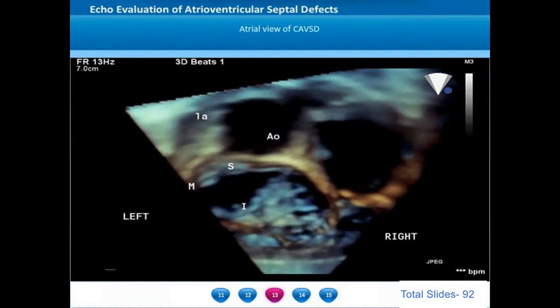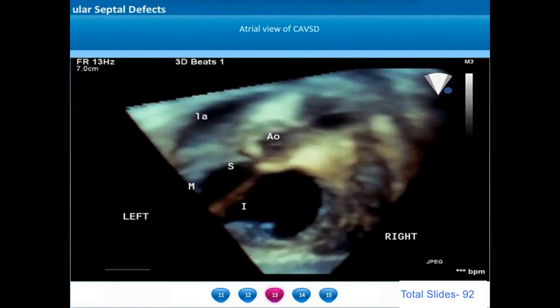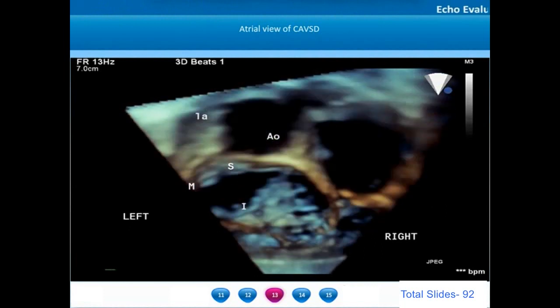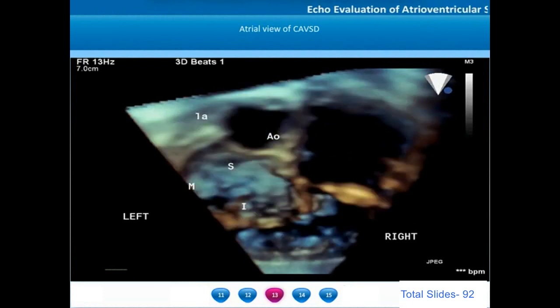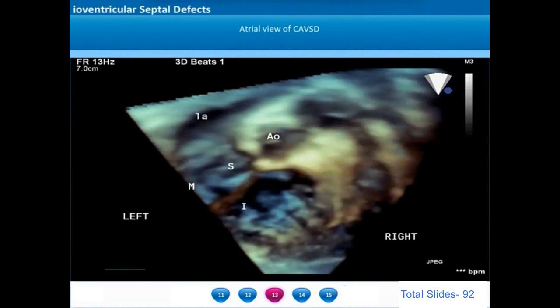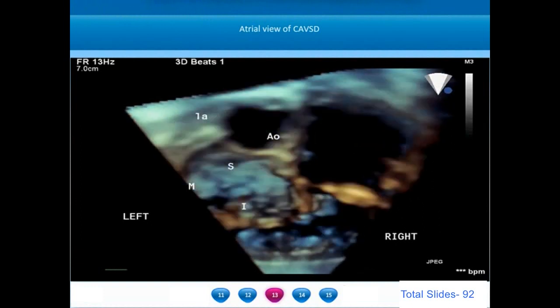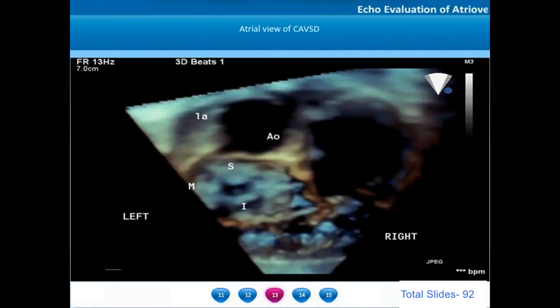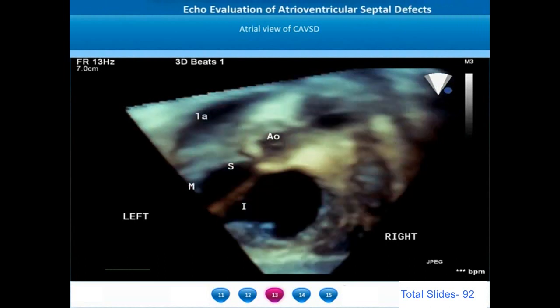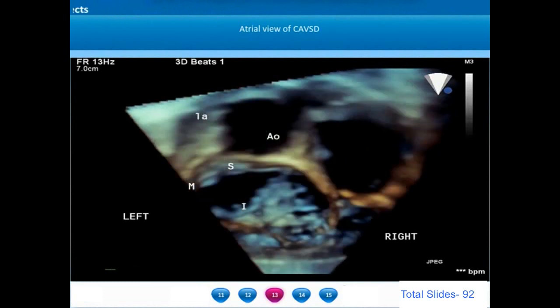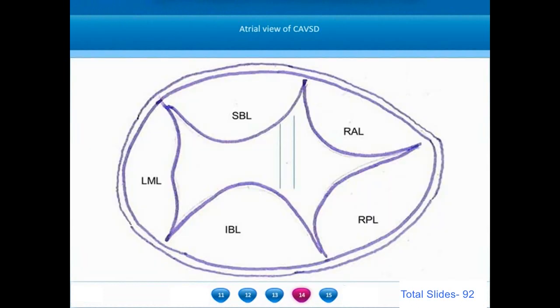The atrioventricular valve can also be seen from the atrial view, which is the equivalent of the surgeon's view. The superior and inferior bridging leaflets are named S and I, and M refers to the left mural leaflet. The dilated left atrial appendage is shown anteriorly. The aortic root does not get wedged between the two AV valves as in a normal heart — in a complete AV septal defect the aortic root is anteriorly displaced.